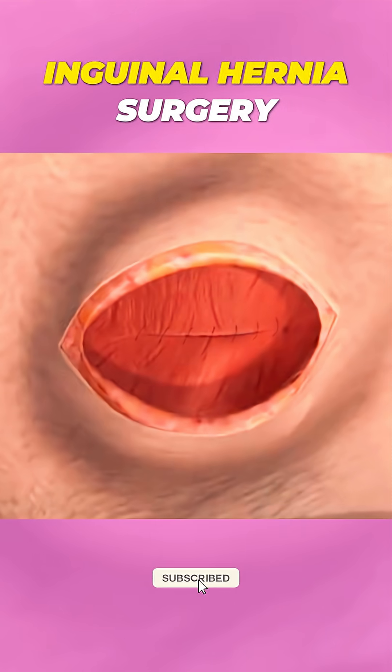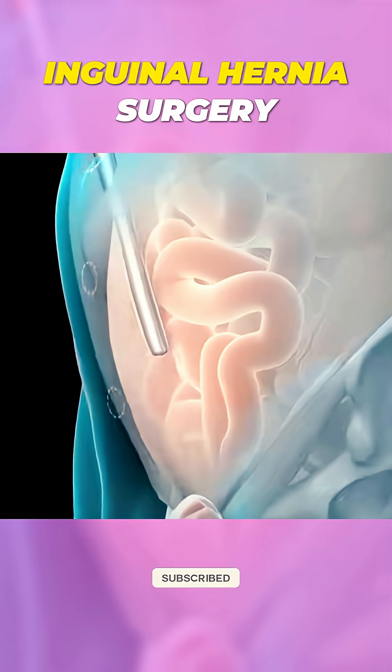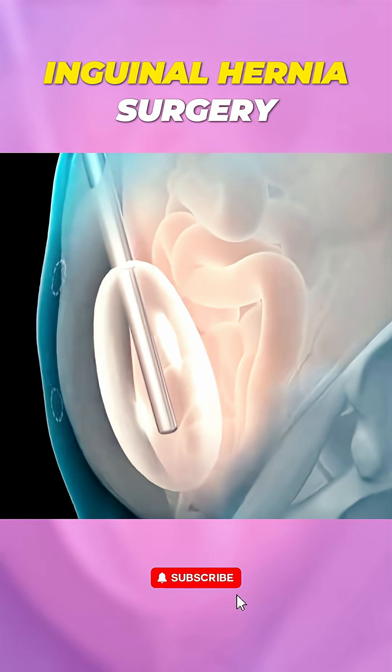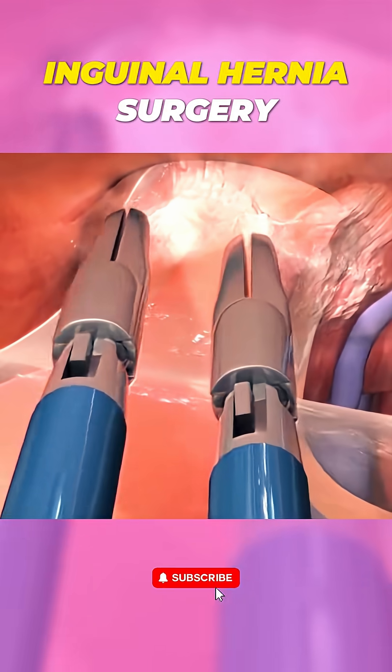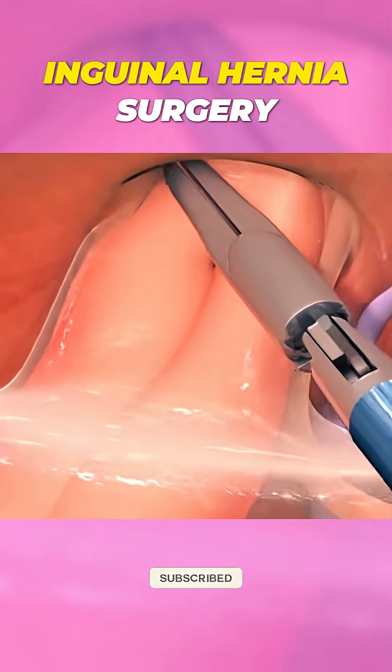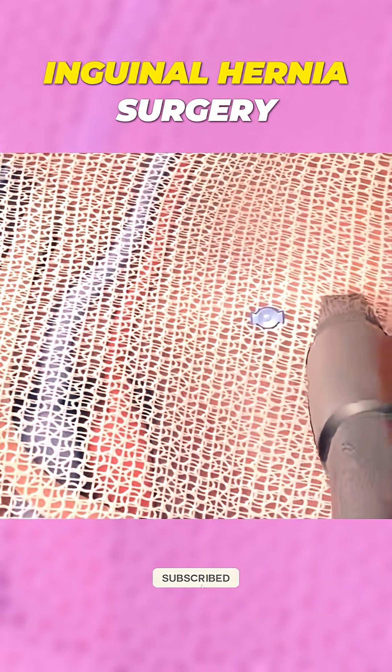The incision is then closed with stitches or staples and the procedure is complete. In laparoscopic surgery, small incisions are made in the abdomen and a tiny camera is inserted to guide the procedure. The hernia is repaired with mesh, just like in open surgery, but with less scarring and faster recovery.